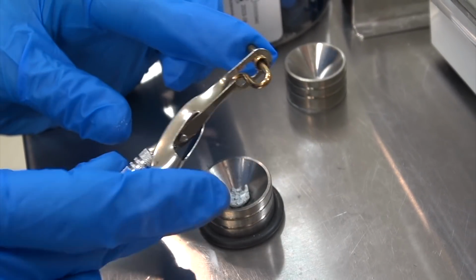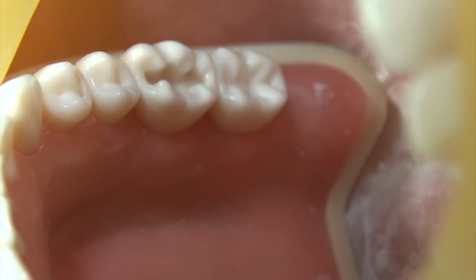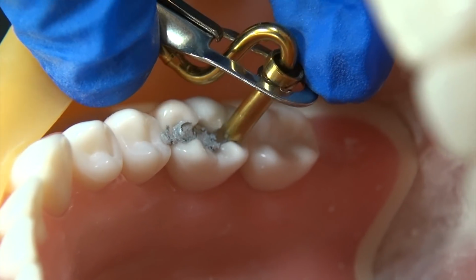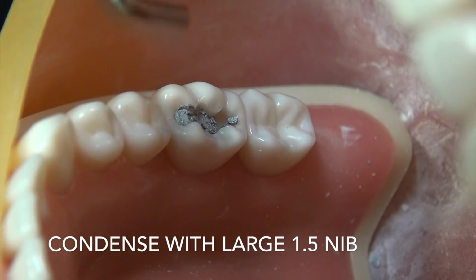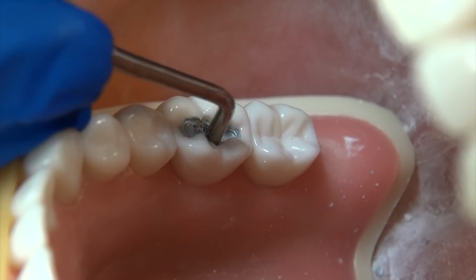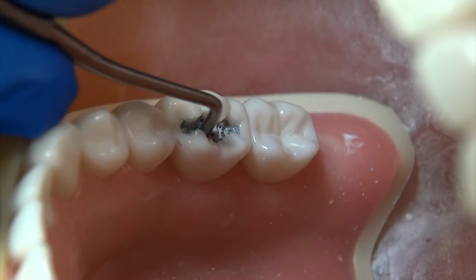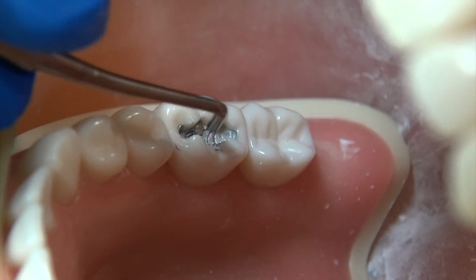Now, once you get a little amalgam in, you can lightly press on the carrier to be able to condense it within the carrier. Okay, you want to start at one end, and as you're dispensing the amalgam, you want to slowly move over in the restoration to where you get pretty even distribution. Now, first you're going to use the large nib to condense initially, and then you'll change over from the 1.5 nib to the 1 millimeter nib. Now, as you're decreasing in size in the nib, you're able to apply more pressure into a smaller area.